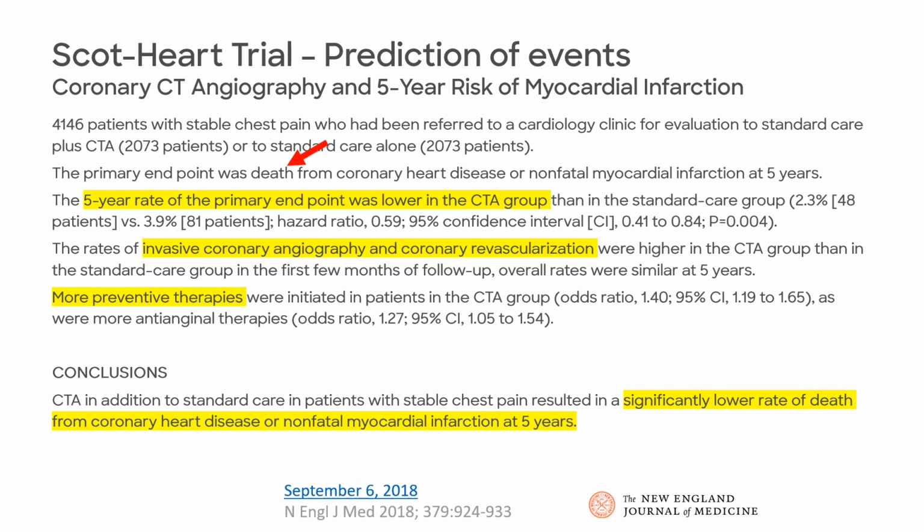We know this from the COURAGE trial and the ISCHEMIA trial, that you're not dying for lack of a stent, even with having chest pain. But what you are doing is you're seeing inside the wall of the artery, as opposed to a stress test where you really don't have any insight into what's going on in the plumbing. With a CT you can actually say, hey, you may not need a heart cath, but you've got plaque in your arteries, and so we're going to start you on aggressive therapy. Statins, aspirin, blood pressure, diabetes control, all that stuff. Whereas with a stress test, the only question we're answering is, are you or are you not high risk, and do you need a heart cath?